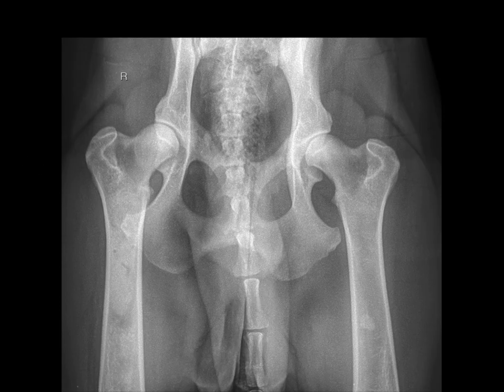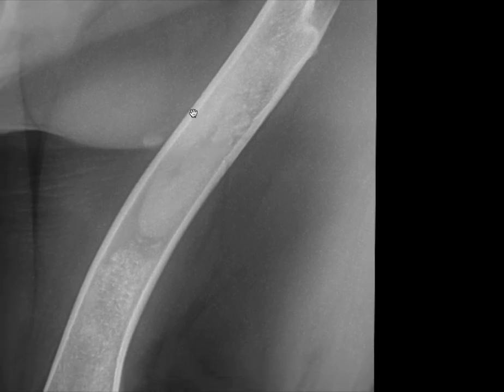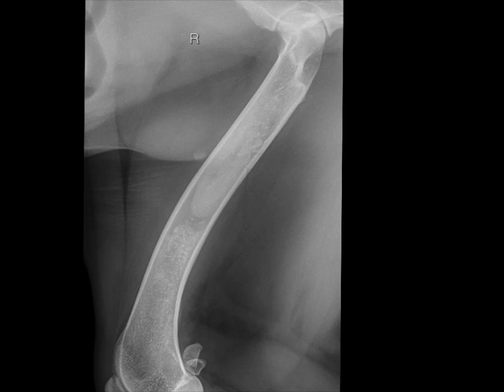Now, let's get back to discussing the status of the medullary cavity. When we have multifocal, which I like to use the term polyostotic, medullary opacities affecting multiple bones, the most likely differential given the patient's signalment and history is panosteitis. Increased opacity in these cases, we think, relates to reduced medullary fat being replaced by inflammatory cells and edema, which has more of a soft tissue opacity.